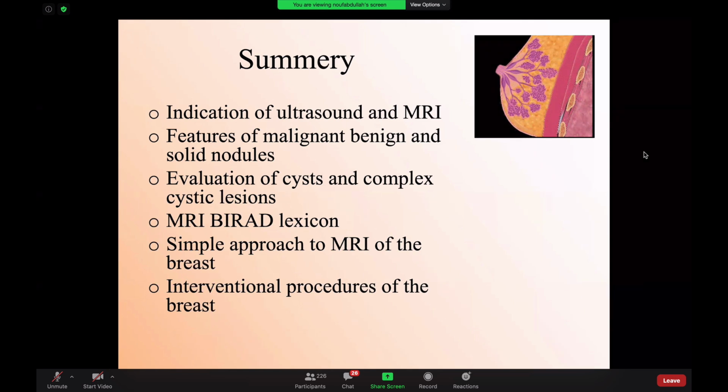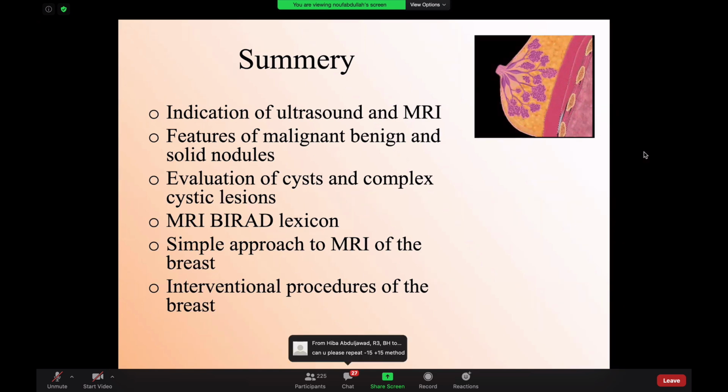Okay. In screening mammography, is it necessary to do ultrasound in dense breast? It is usually very important because there is a very high chance that you might miss cancer. Screening ultrasound in dense breast can pick up 3 cancers in 1,000 patients, so you might miss 3 cancers in 1,000 patients. So I would always say, if the patient is coming for the first time with dense breast, I would do ultrasound.